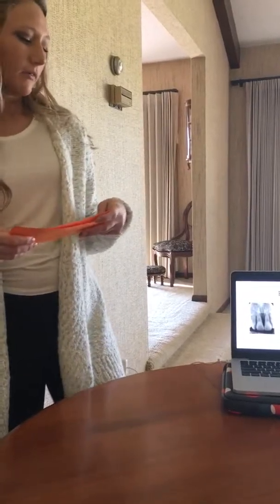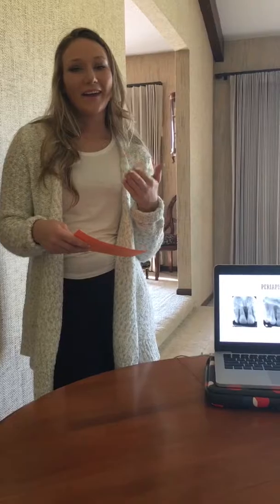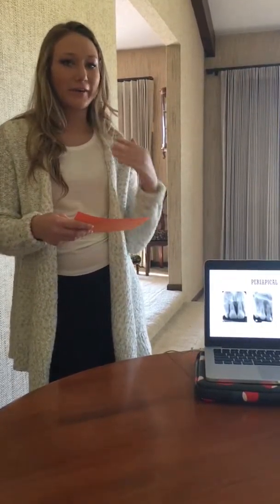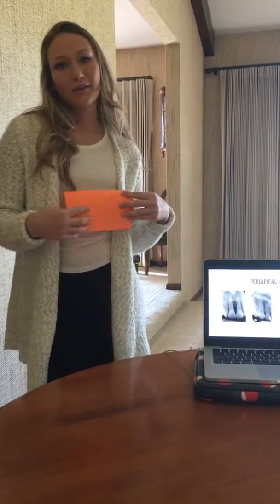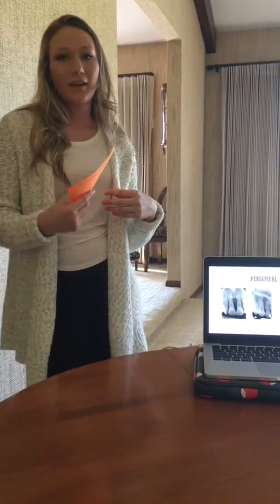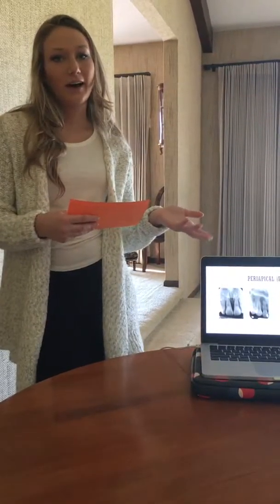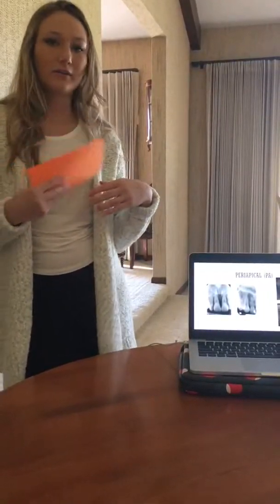And in the maxillary, which is the top arch, we have the central PA, the lateral PA, and the canine PA. Then there's also the premolar and the molar. So there will be 5 in the maxillary. And then for mandibular, there's only the central, and then the canine, premolar, and the molar. So there's only 4. You will not need a lateral PA in the mandibular, which is the lower arch.